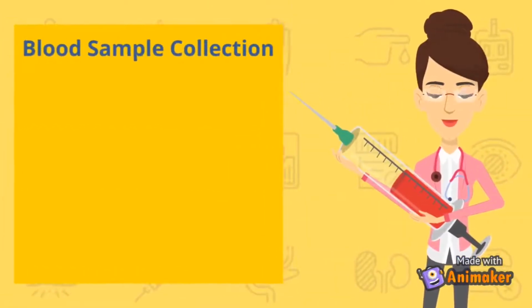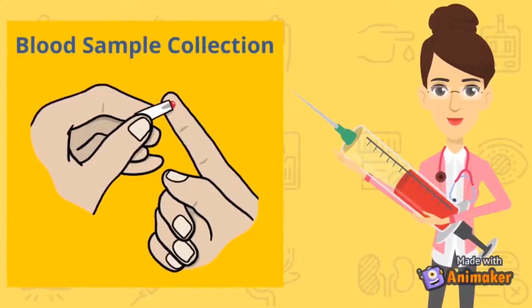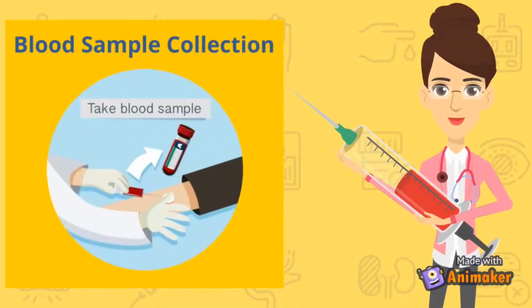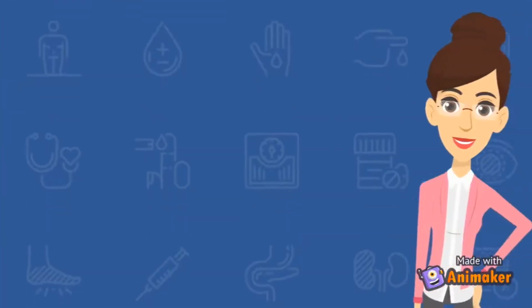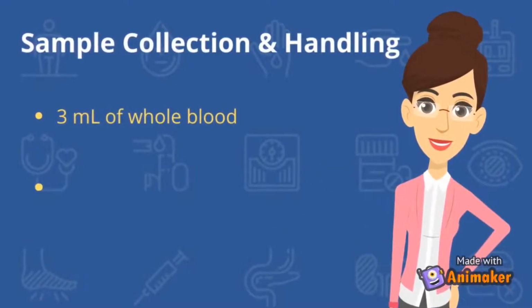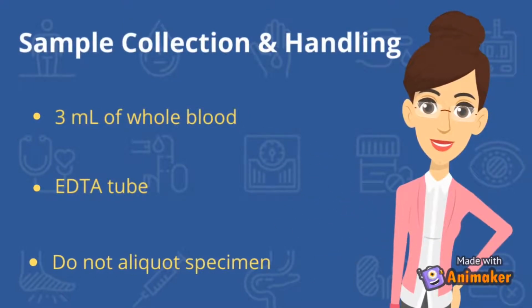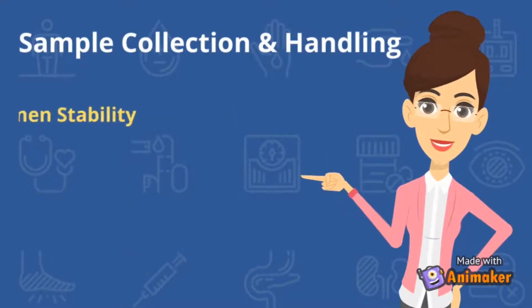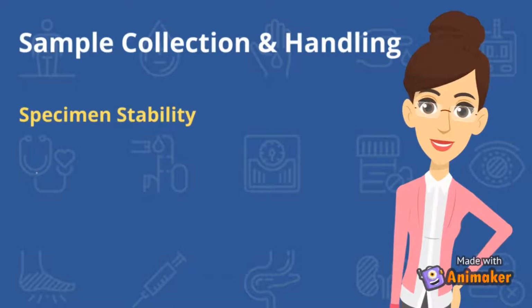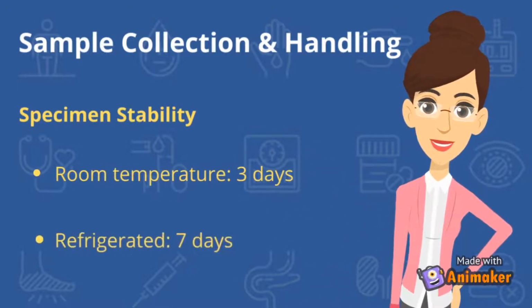A blood sample may be taken in two ways, either by pricking a finger with a short pointed lancet or by inserting a needle into a vein. The sample collected must be approximately 3 ml whole blood in a lavender top EDTA tube. Do not aliquot the specimen as it must be sent in the original tube. The specimen stability may last up to 3 days at room temperature, but if it is refrigerated, which is preferable, it could last up to 7 days.